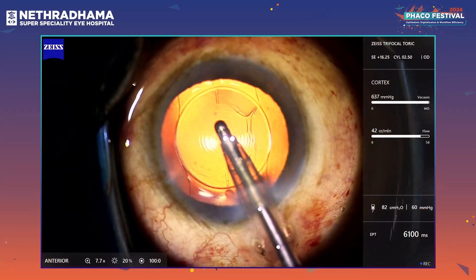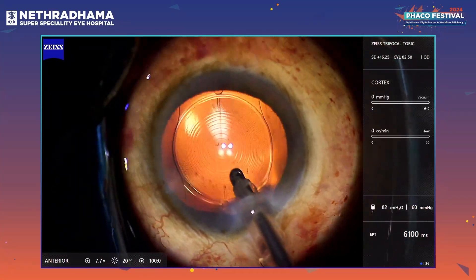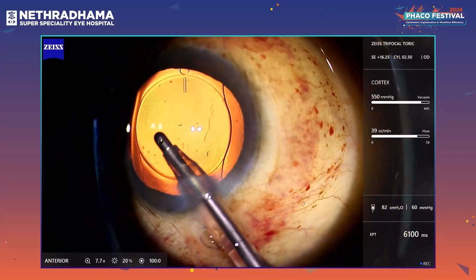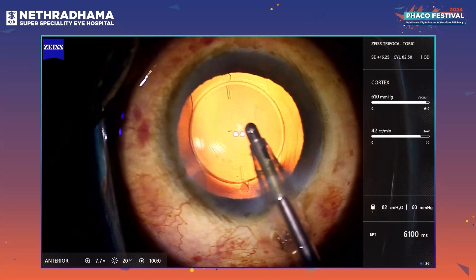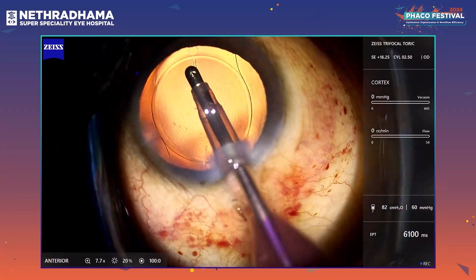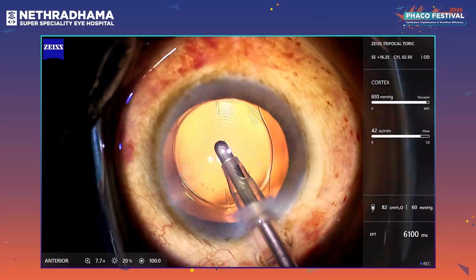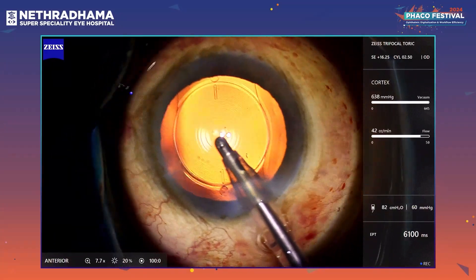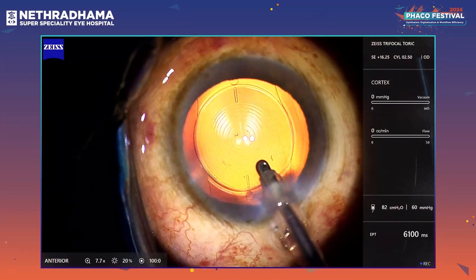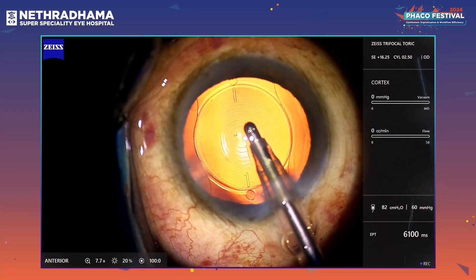I'm using HPMC 2% viscoelastic. I routinely use HPMC 2% unless I need a cohesive viscoelastic for some specific reason, or a viscoat — if it's a very dense cataract to protect the endothelium, I will use a viscoat. The lens appears fairly stable and it's well aligned on the Intelli axis of the Lens AR system.